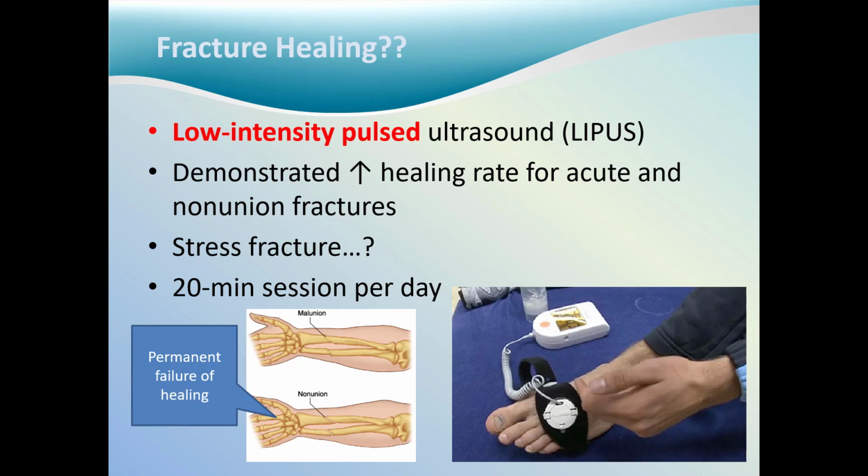Low-intensity pulsed ultrasound, which is sometimes abbreviated LIPUS, has been demonstrated to increase healing rates for acute and non-union fractures. So this begs the question, do you think this could be a good treatment for stress fracture? Stress fractures are a common injury in runners and many athletes, so we may be able to use ultrasound to facilitate an optimal environment for bone healing with certain ultrasound parameters. Treatments have been suggested to be approximately 20 minutes per day with this low-intensity pulsed ultrasound, and the research is looking promising.